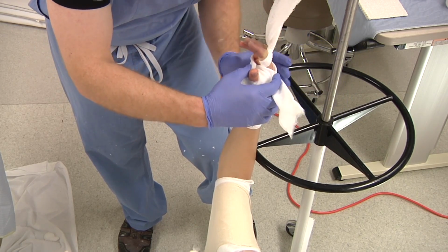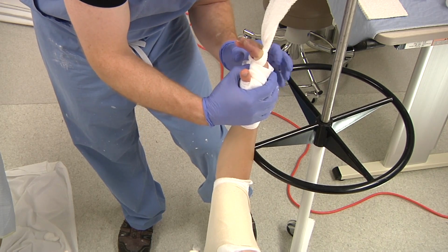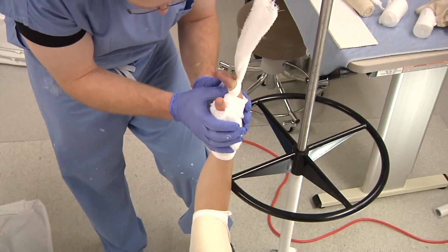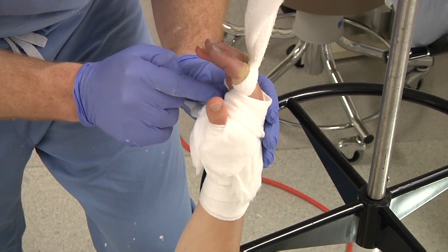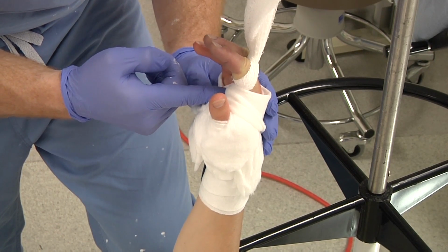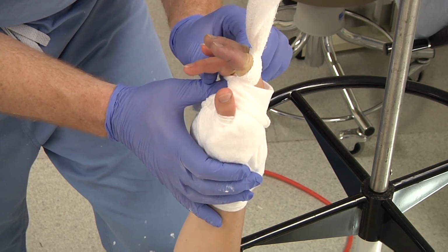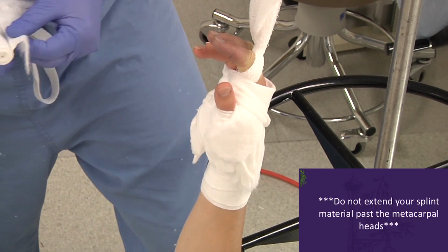You do need to be cognizant of where your padding is going to be ending. Where your metacarpal heads actually are, you have your knuckle, so it is pretty high up on the back. But then also on the front, it's deceiving how high you do need to go, because you can't simply stop at the distal or the proximal palmar crease. You can bend the finger to actually see where it articulates and where your metacarpal head is. So you do want to extend to that level, or past that level slightly.